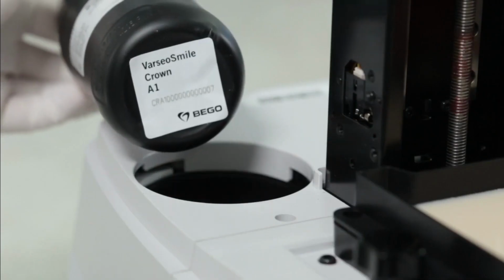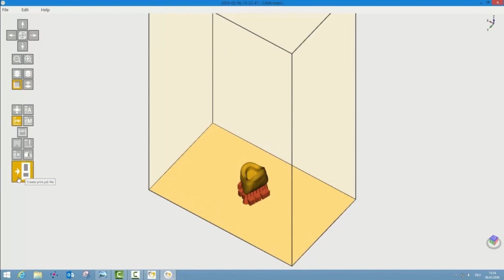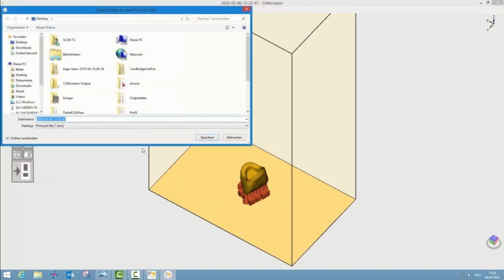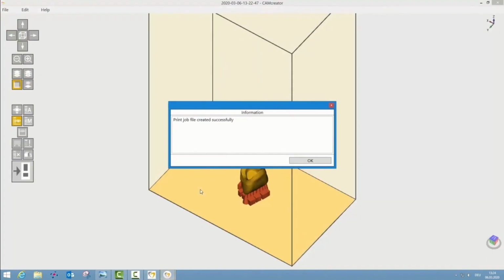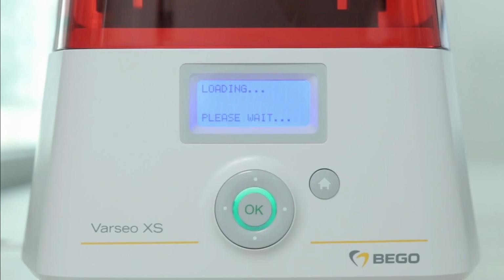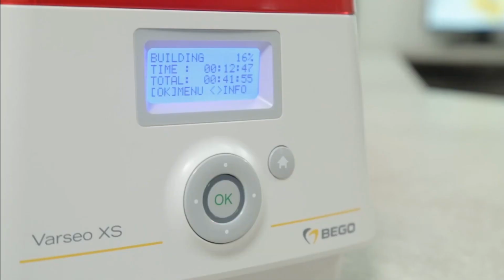Okay, so that was the resin tray being filled, and the bottle of material goes in the printer, and that's how it knows if the right material is loaded. If the right material is not loaded, you will receive an error when you transfer the job from the CAM Creator to the printer. So the printer checks that data, and if it's good, it will receive it and start printing. And as you see, my colleague is checking the print job to make sure it's working, but otherwise it's hands off.